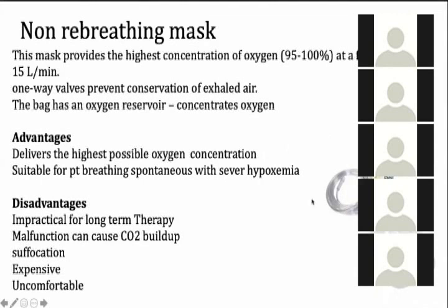You will see that this mask is a bit different because it has some valves and it has a large reservoir bag attached to that mask. Because of these manufacturer properties in the bag, you can deliver a very high percentage of oxygen to patients, like 95 to 100%.